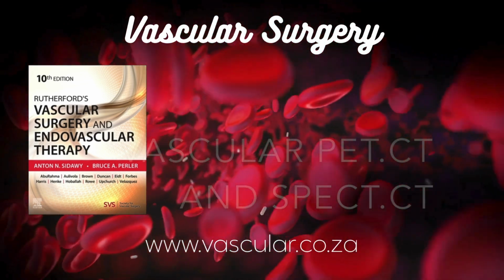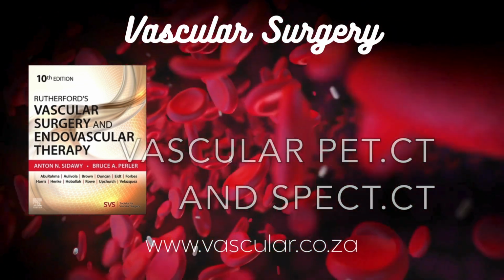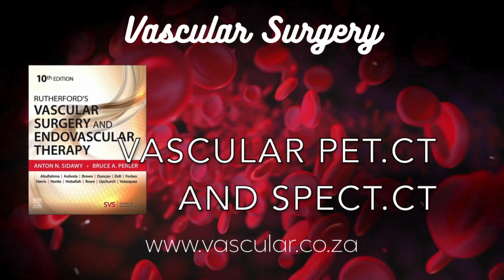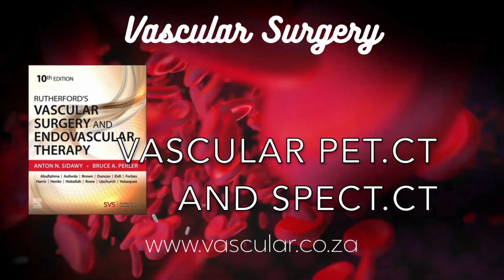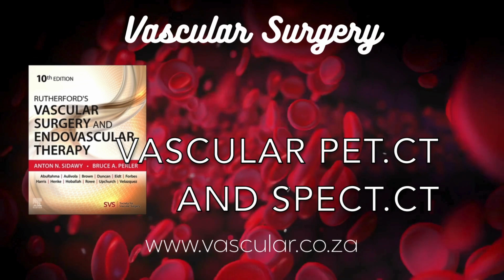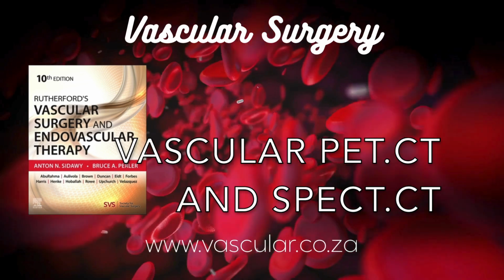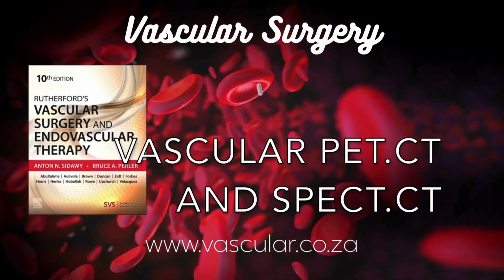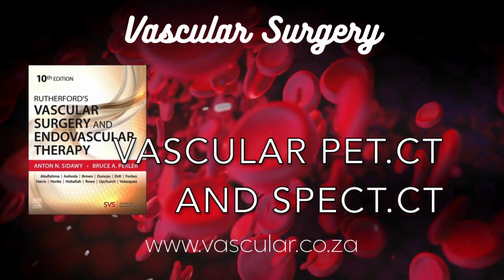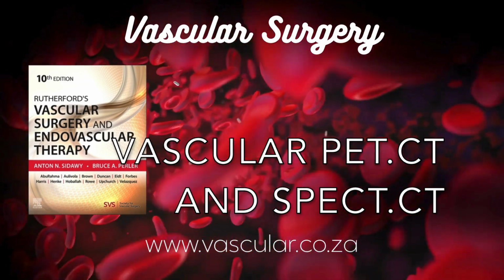Well, it turns out that NaF also accumulates in areas of active calcification within atherosclerotic plaques. So not just existing calcium, but where calcium is actively being deposited? That seems to be the idea. It's targeting the process of microcalcification, which might be linked to plaque instability. And a potential advantage over FDG, especially for coronary arteries, is that NaF has very little uptake in the heart muscle itself or in normal blood vessel walls. FDG uptake in the heart can sometimes make it hard to see uptake in the nearby coronary plaques. NaF avoids that issue. Interesting. So FDG for inflammation, NaF potentially for active calcification.